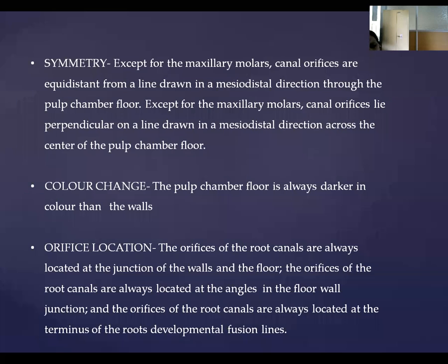So, first, the canals are always at the end of the developmental grooves. They are not located in between. They are located at the ends of the developmental grooves. So, three rules are there. One is that they are always located at the line angles of the walls and the floor.